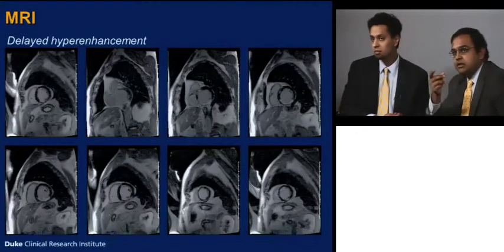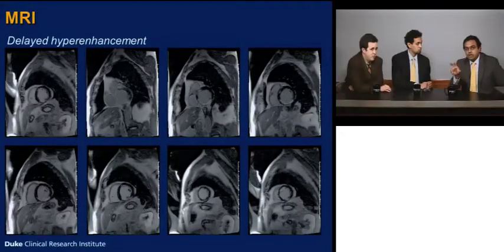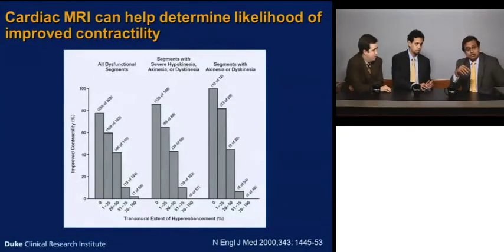I guess I would say, just looking at the pictures, that it's transmural, or near transmural, in some of them. And what we do in the MRI lab when we're looking at viability is a segmental analysis: for the inferior segments, for the total area, some percentage of the wall is infarcted. And from Ray Kim's data and others, that transmurality, the percent of infarct, tends to relate to the percent of wall motion recovery. So 50% infarct in the wall, 50% chance the wall gets better. 75% infarct, 25% chance the wall gets better. Just a rule of thumb.